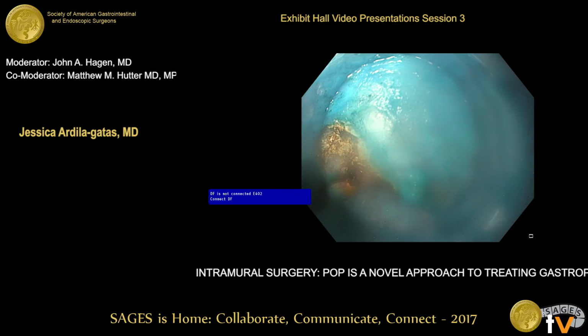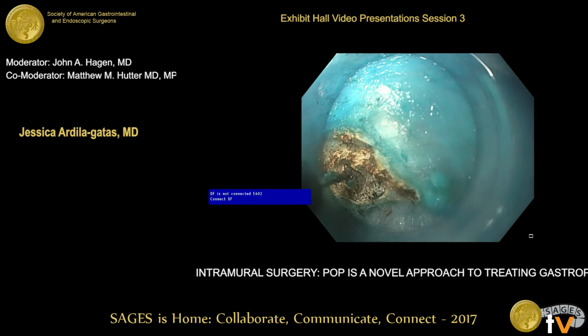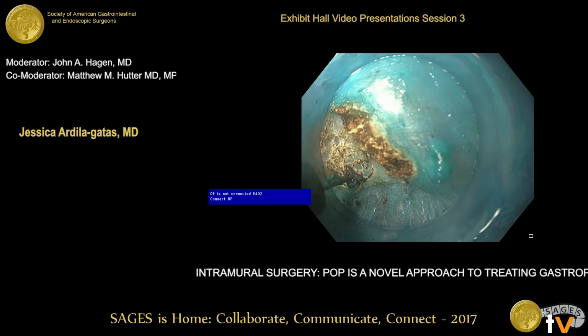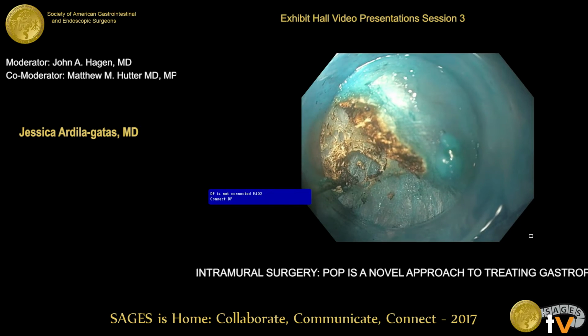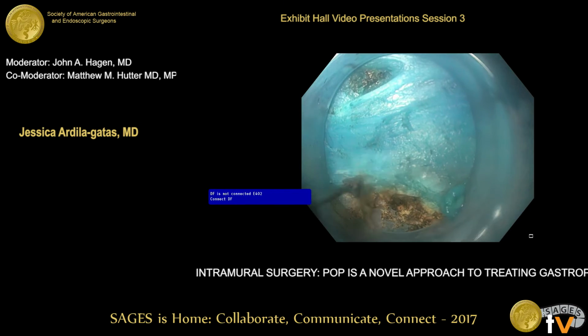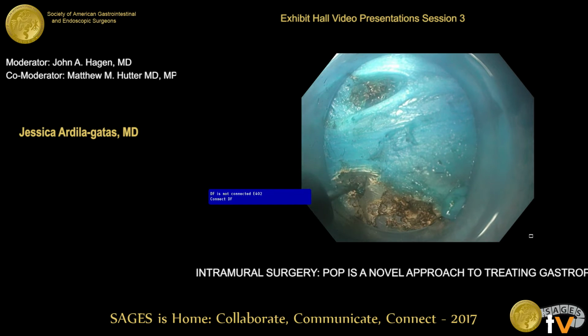In our institution, we have performed just above 50 of these cases in the past year, having good results and good patient satisfaction. So to identify when we've transected the entire muscle, we transect all the white fibers, and then we see the serosa posteriorly with a thin blue stain from the injection of the methylene blue.